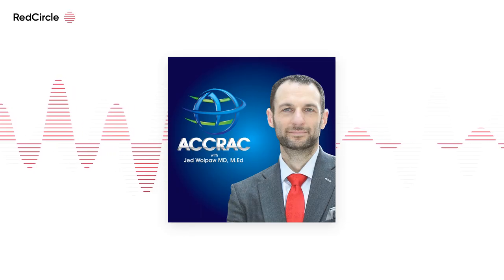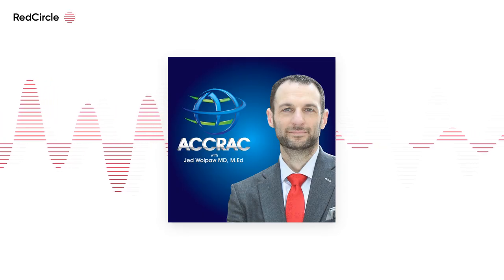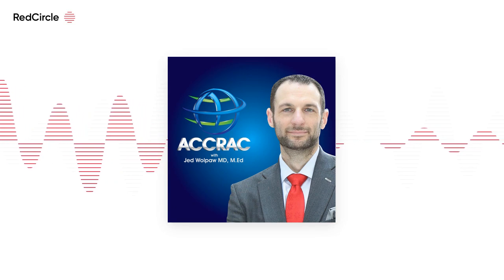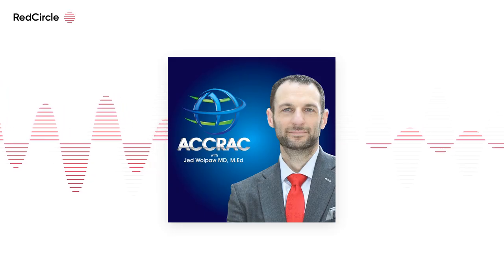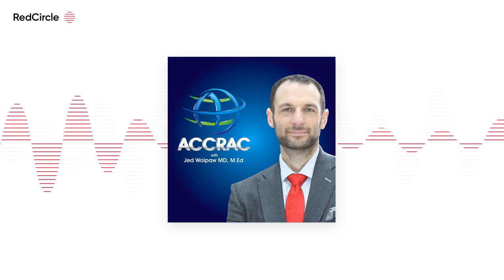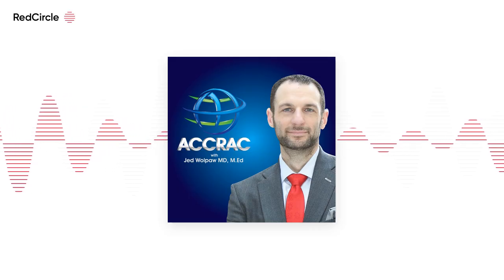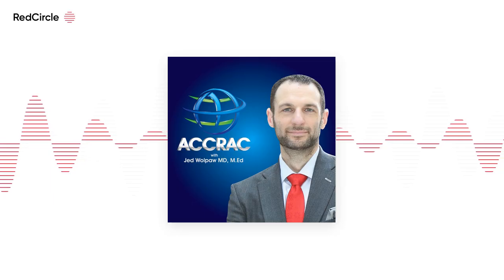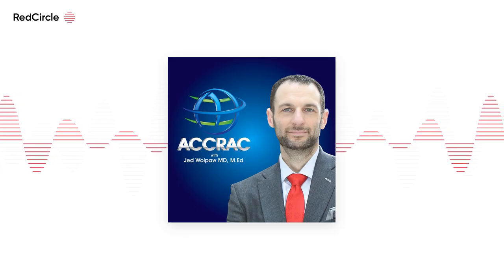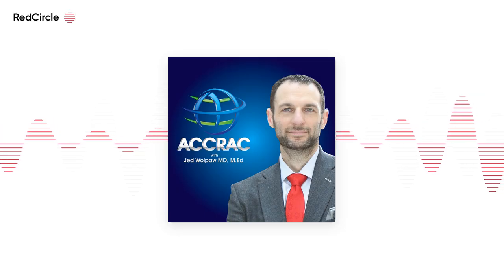So then it came down to, okay, you're going to start at a higher level of PEEP and come down. Then the question is, do you try to recruit the lung with a higher pressure prior to doing this? And originally that was exactly the method. Essentially, you do a lung recruitment maneuver. And for some people, that would have been 35 for 30 seconds or 30 for 30 or 40 for 40. I always argued that 30 for 30 had been shown in studies not to do essentially anything. If you're trying to recruit or pop the lungs open, you need to exceed pressures that you're typically ventilating at. And keeping your plateau less than 30 with ARDS patients, that's not a recruitment maneuver.